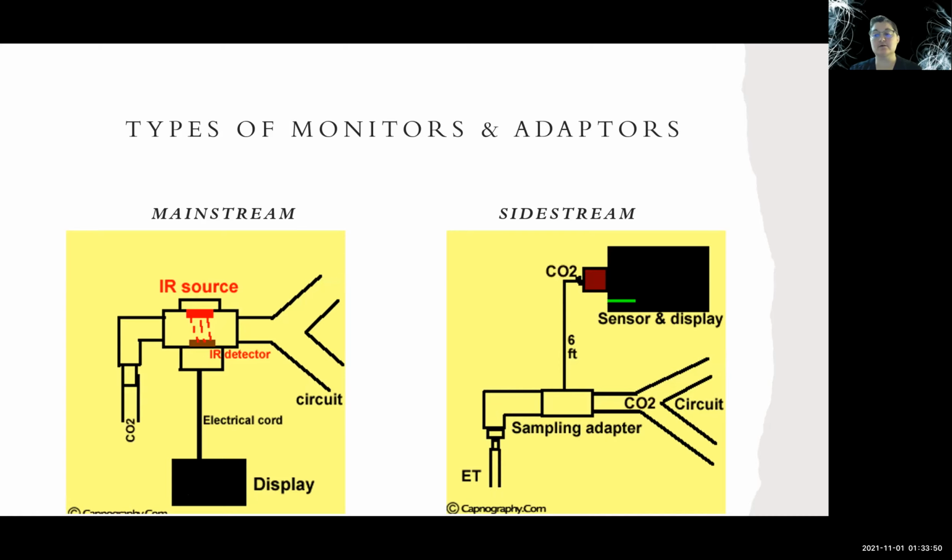So ultimately, colorimetry is not commonly used. If the membrane in a colorimetry device turns yellow, which implies that we have greater than 2% end-tidal CO2, this means that the device may be contaminated with acidic substances like gastric acid, lidocaine, epinephrine, things like that. The device is unable to give a reading when it becomes clogged. So if it's broken, or if there are secretions within the device, then this device is useless.